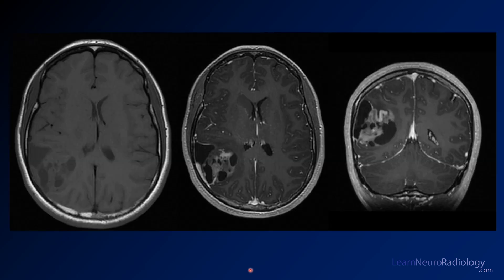On pre-contrast imaging, the mass has areas that are isointense to hypointense, with hypointense cystic areas. On post-contrast imaging, there is avid enhancement of the solid central components. There is also a dural component that is thick and enhancing — a dural tail — which is a classic finding for this lesion. Coronal post-contrast imaging confirms dense central enhancement with a surrounding cystic area.